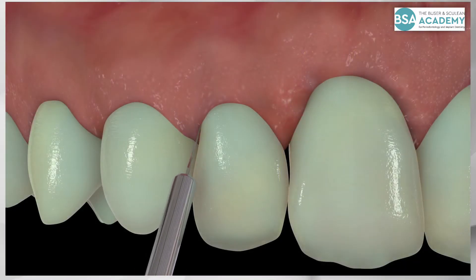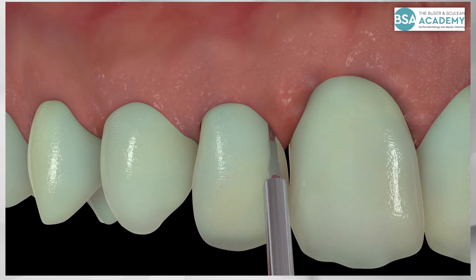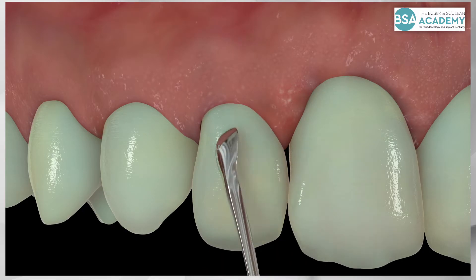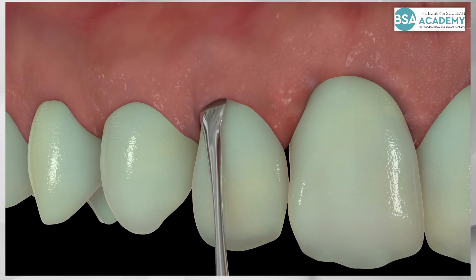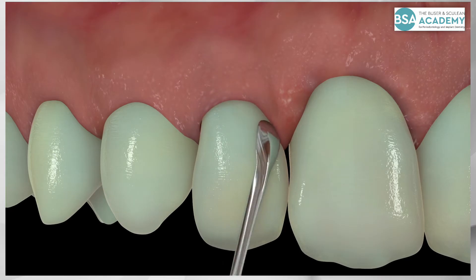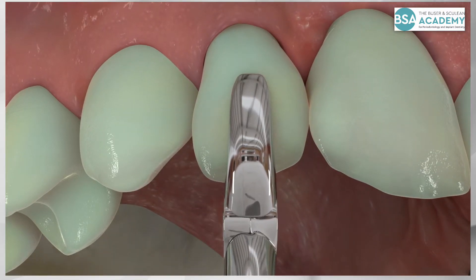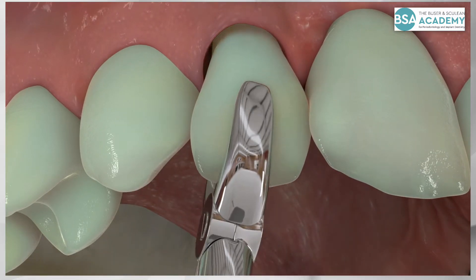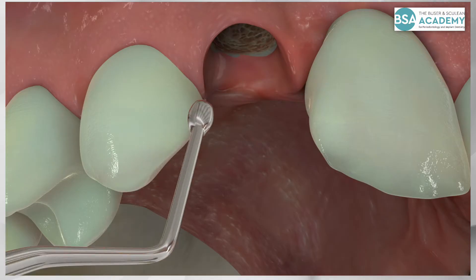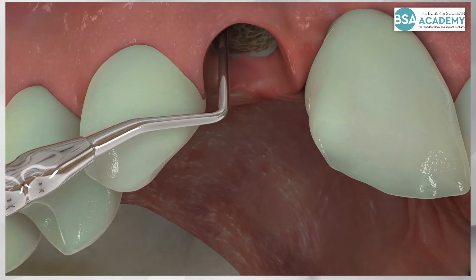The extraction is initiated with an intrasulcular incision using a micro blade. The gingival margin is carefully mobilized with a fine periosteal elevator. The extraction is carefully done with a rotational movement. The socket is debrided to remove the granulation tissue.